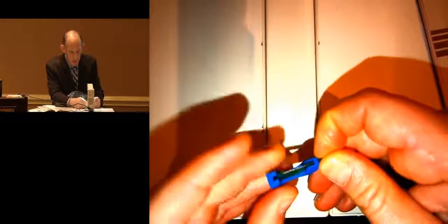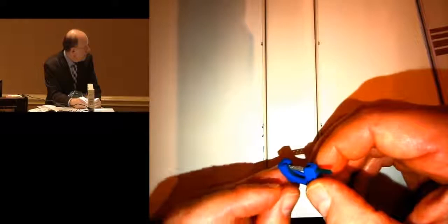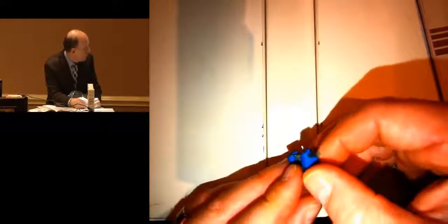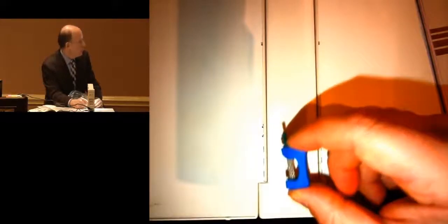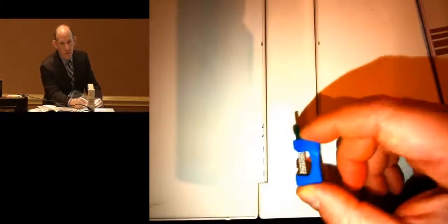Take the handle, stick it through the hole, and then you're going to have to snap this thing all the way down. When you go like this, don't put your thumb on the edge, you'll cut your thumb. Rather, hold it down on a counter and then push, and you'll feel it snap into place. When it's done right, you'll see that the file actually sits below the edge of the rubber a little bit. Okay? This is how you hold it when you do your IPR, and this becomes very doable.